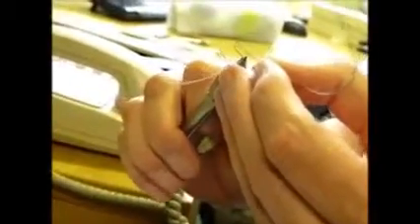So we're going to measure up. Say we do the next one adjacent to, just for an exercise. We just bend it up here, so that's where you decide you want it to be. Then you can make a bend here, and you measure the height of the thing again. Is that in the right place? So you roughly have them all the same height, and you can put that in there. So that now, if I make this one a bit the wrong size, when it comes back down, because they want to be reasonably tight and keep those reasonably parallel.